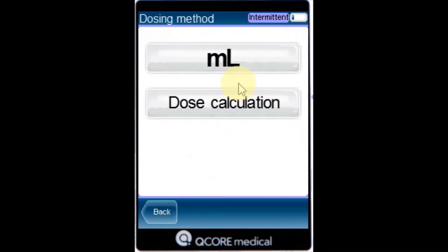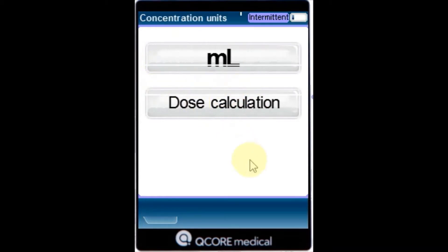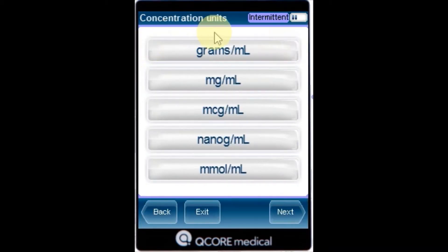If the dosing method screen appears, select dose calculation. From the concentration unit screen, select the appropriate drug units.